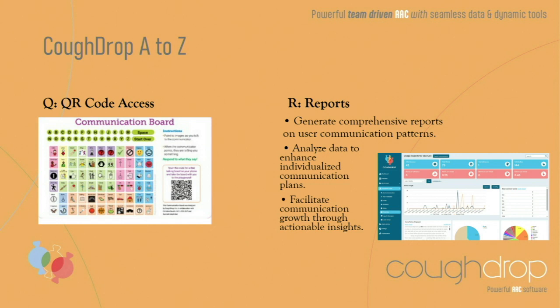We're also working with other organizations like the Florida Aquarium and some other amusement parks to start implementing and rolling this out. So if you think about the different places that you go, and as a parent, being able to scan that and have access is pretty incredible.